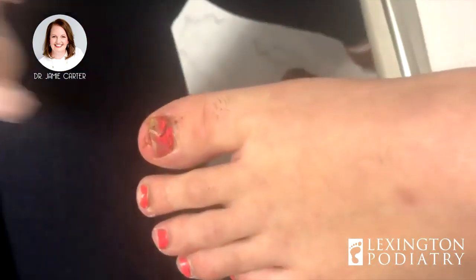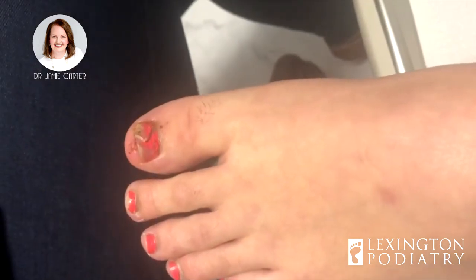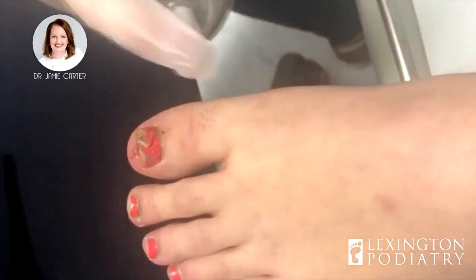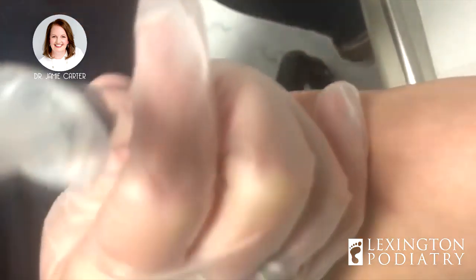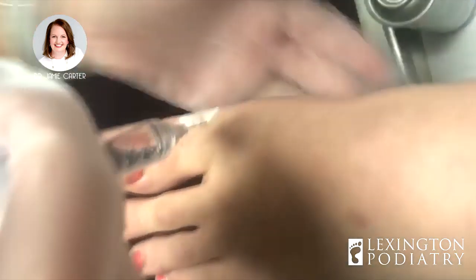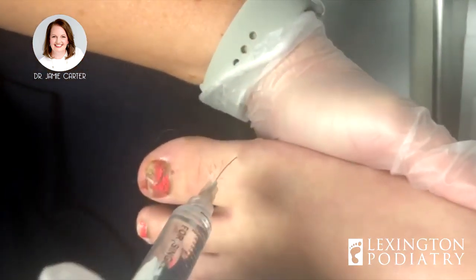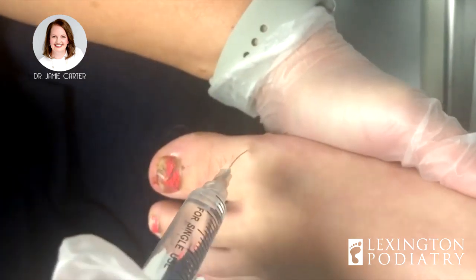So now we need to alleviate the pressure by taking the entire toenail off. We start with two pokes — an injection. We'll spray some cold stuff on it and a little poke. Now it's going to burn and sting — that's the medicine moving throughout your toe. Let me know if you need me to stop and give you a second.